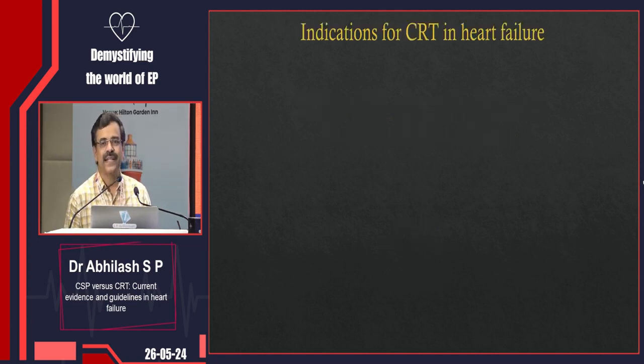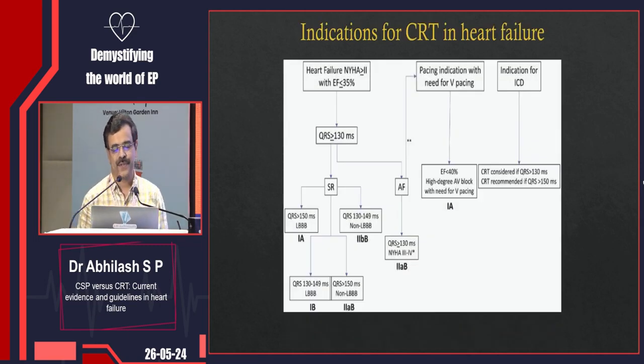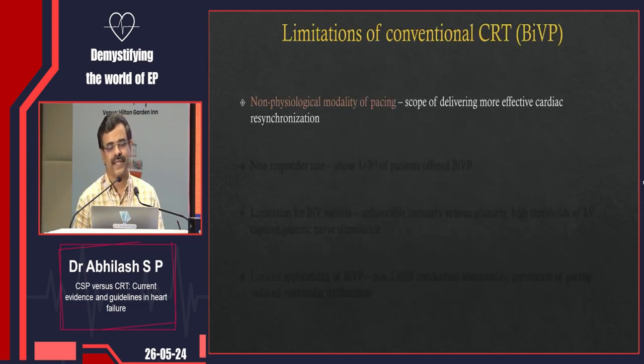So, the indication for CRT in heart failure is straightforward. I need not spend much time on that. It's a bit of a complex algorithm, but we know it. Then, there are limitations for the CRT.